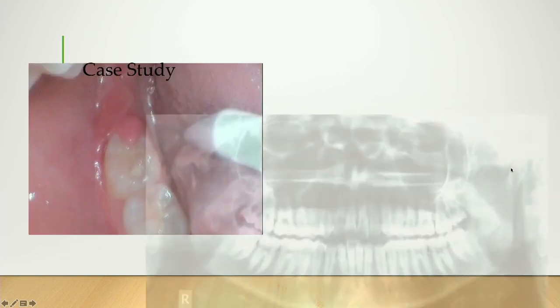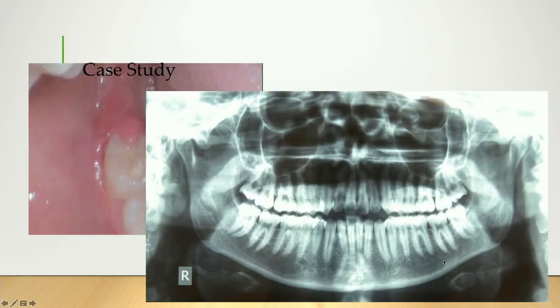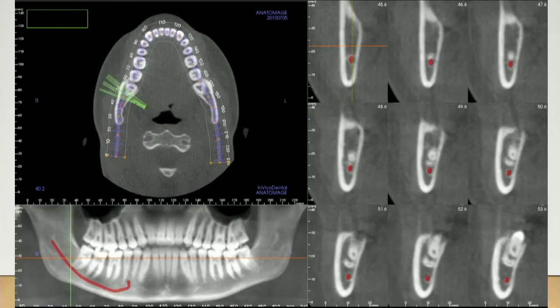So we used this case study before to have a look at the 4/8 and the 3/8. In this instance, if we look at the 4/8, there's a number at the bottom here. For example, this number here is 50, this number is 40, and that corresponds to the number on your sagittal or axial view, okay? That then also corresponds to your axial view here with these numbers.